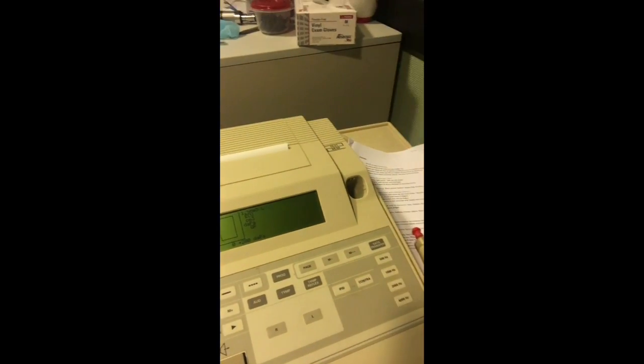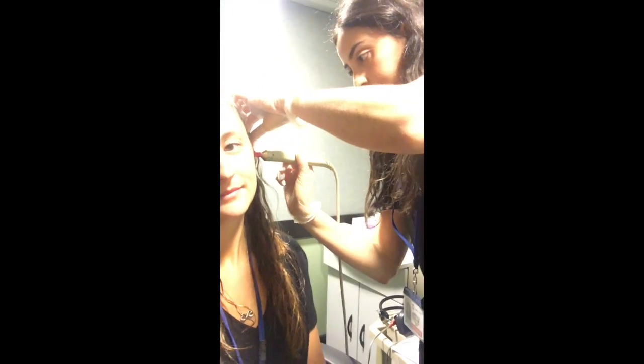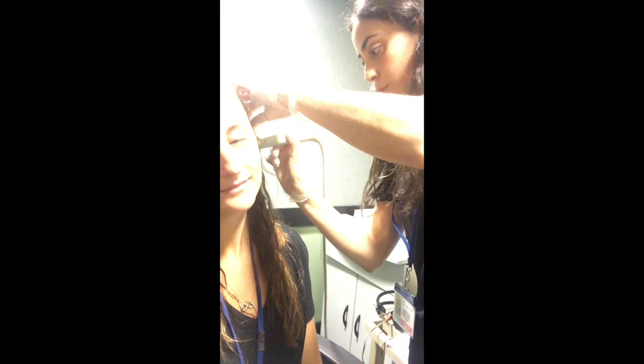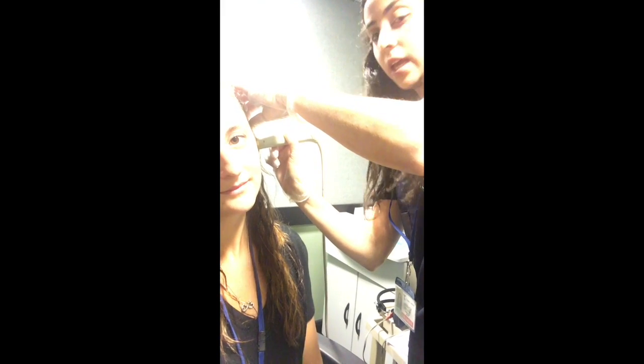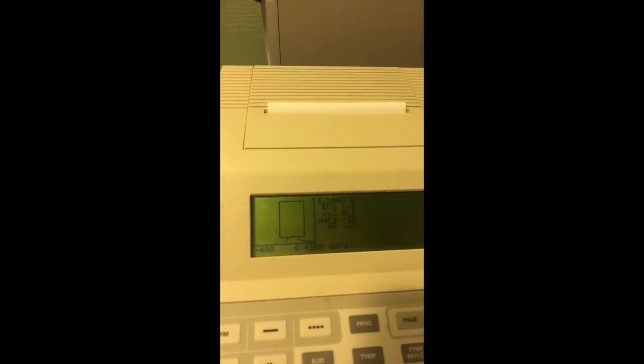Now I'm going to switch over to the left side by pressing L. The blinking green light indicates that it is ready to be used. I'll lift up her ear again, insert the probe tip, and I have a steady green light. Once the green light turns off, that means my results are ready. Here is her tympanogram — again Type A, indicating that she has normal middle ear function.